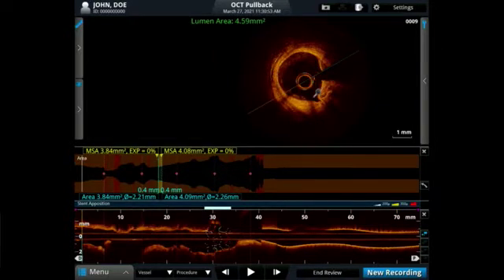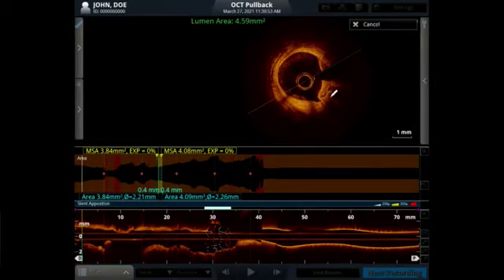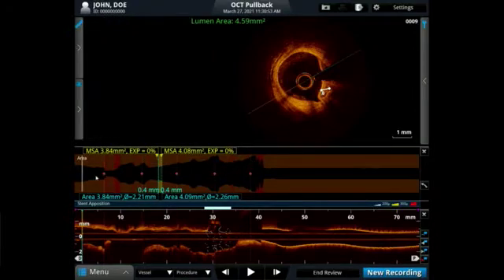This is right here for non-OCT users and IVUS users. On IVUS, you would see calcium here. There's no doubt, and you definitely see dropout. But the well-demarcated kidney-shaped nodule here is your calcium on OCT. This will allow you, for future technologies and modalities when you want to treat, to measure how superficial, how deep, and how thick the calcium is, and you can pick your modality. Everything is done automatically by the machine. Most of the measurements are done by the algorithm installed in the OCT machine, so if you have a doubt, you can verify it. Other than that, you can just trust the machine and move on.